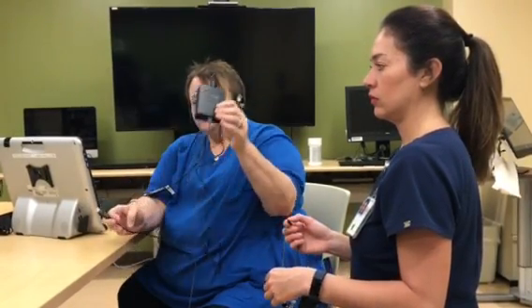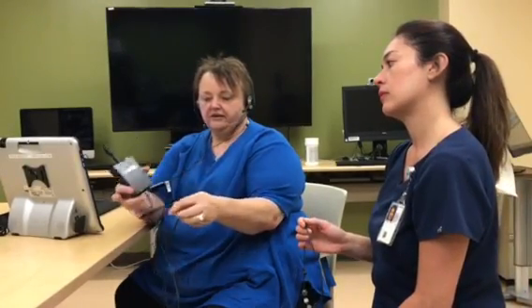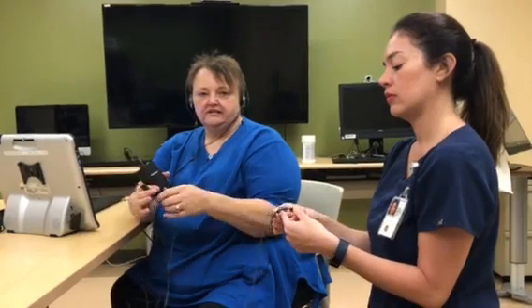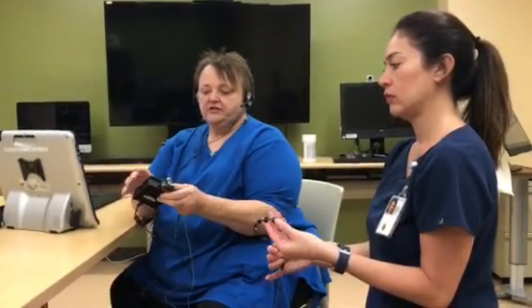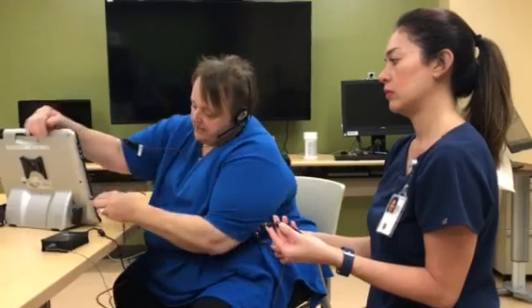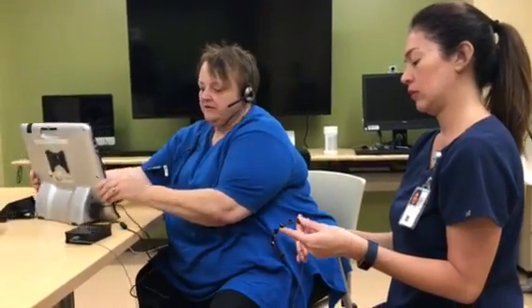The Brain Fingers switch control consists of this little box, which is the amplifier, a USB port, and the actual switch itself that is donned on the head. The first thing we want to do is plug in the USB into the device, and we hear that it's connected.